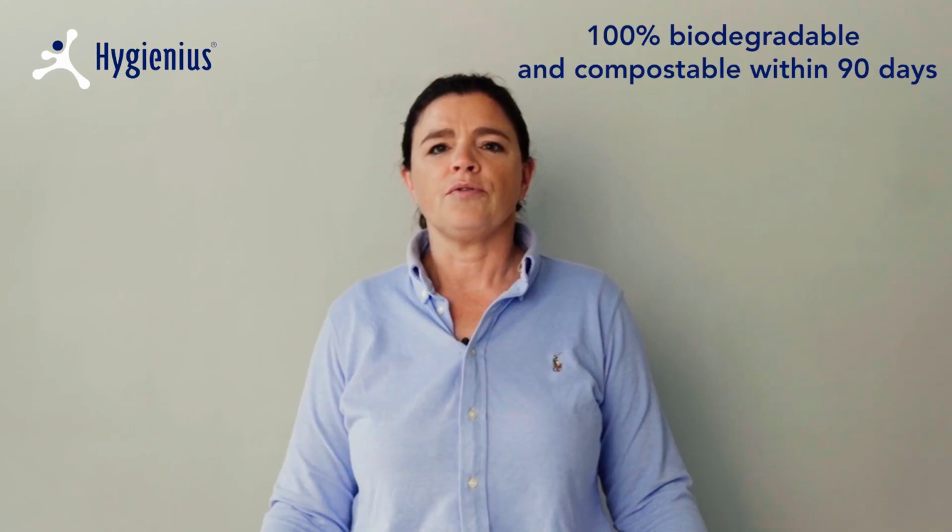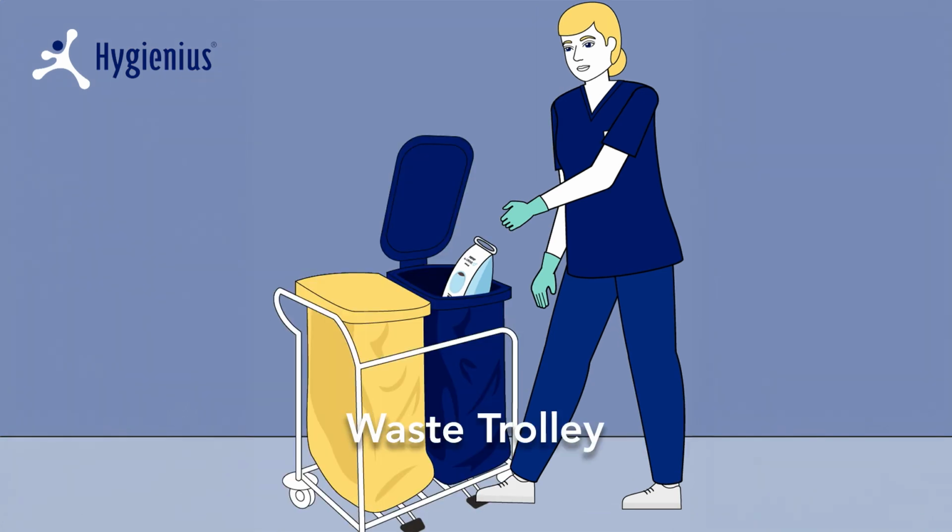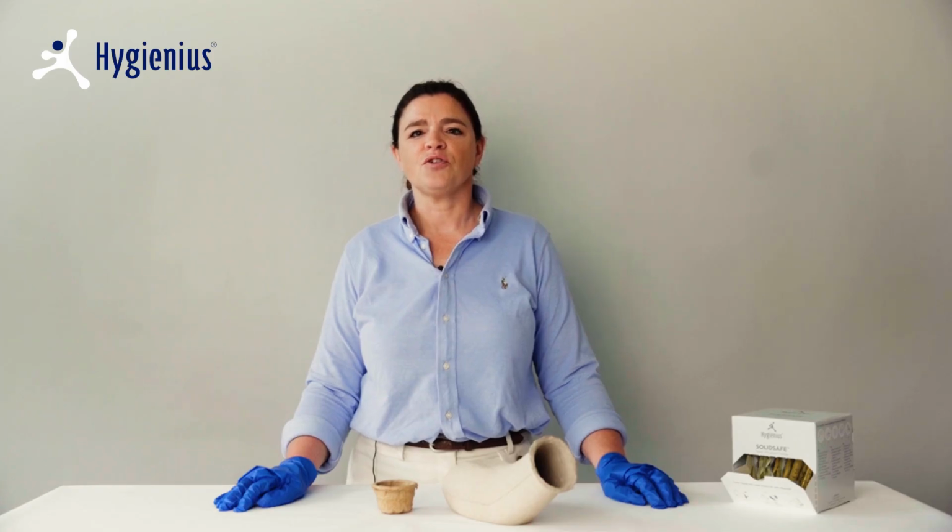Dispose of PROTECTA safely and hygienically in the nearest macerator or waste trolley. That's everything you need to know to use PROTECTA Men's Urinal safe and efficiently.